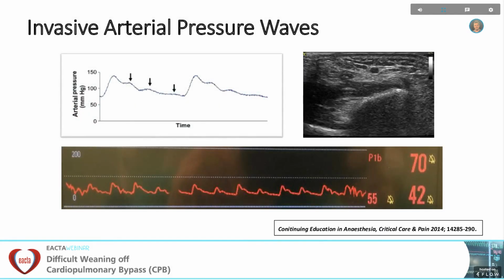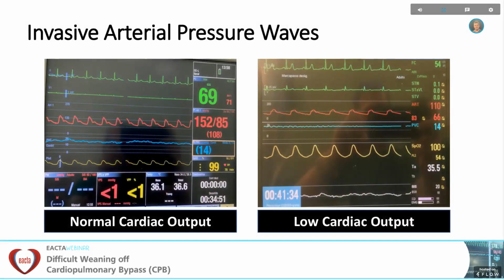Some patients exhibit these several reflections during the systolic phase and the diastolic also, showing a patient with microcirculation damage from atherosclerotic plaques and so on.